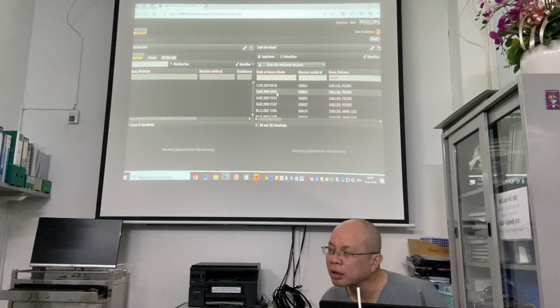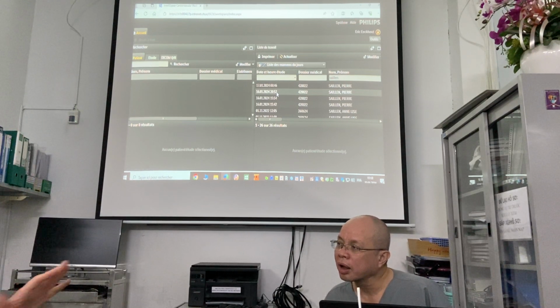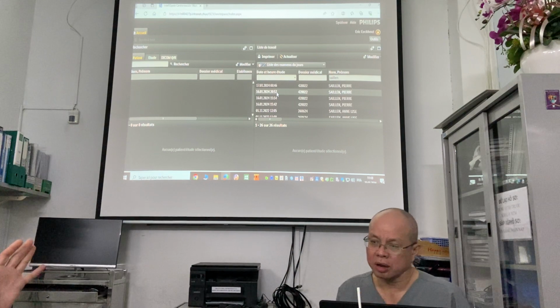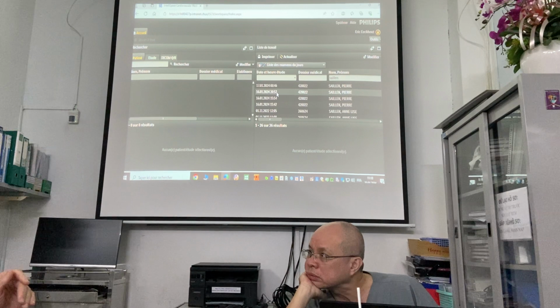I dilate the skin, I dilate the pericardium, I put the drain, and I put on negative pressure, and there is maybe 100, 200 cc of blood. I move the drain a bit, and I have more blood, and I do this under echo, I repeat the echo. The patient says he feels better. He has some pericardial pain also, he has more pain. So everything is compatible with me being in the pericardium. I also do a blood gas. Hemoglobin is 3. So I'm not in a cavity.